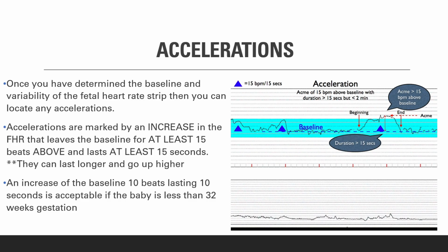So that acceleration there is what we call the perfect acceleration. This means that the baby is healthy. There's no concerns about oxygenation. We like to see a couple accelerations within a 20-minute time frame to indicate that the baby's doing well.